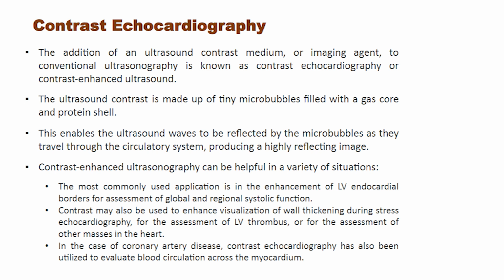Contrast enhanced ultrasonography can be helpful in a variety of situations. The most commonly used application is in the enhancement of left ventricle endocardial borders for assessment of global and regional systolic function.